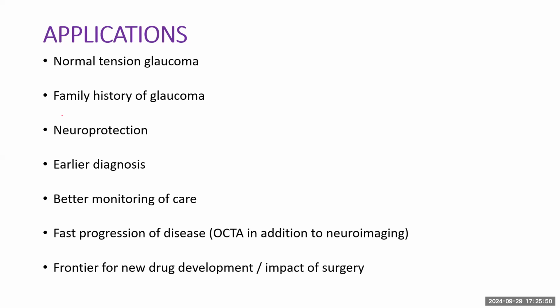Actually, Gabor Holo, who used OCTA, used it first on his own patients with ocular hypertension. Their pressures were in the 50s and the 60s. He took their vessel density while the pressures were high, and again after the pressures had been controlled. What he found was that the vessel density actually increased. He is of the thought that the pressure may cause collapse of the vessels and a relative non-perfusion at the time of the scan image capture. So that could also be a place where OCTA will come in.